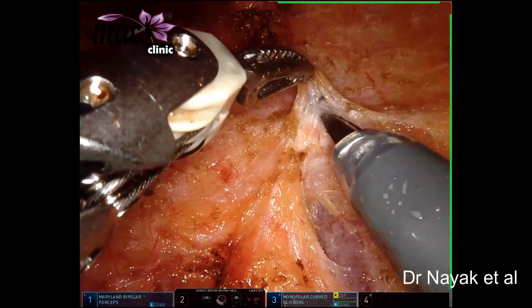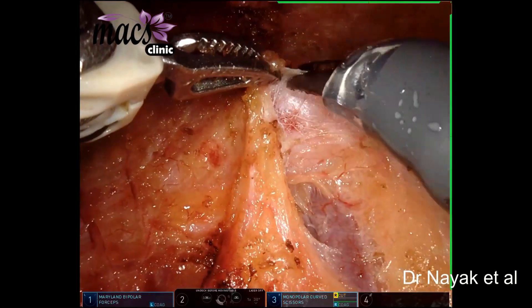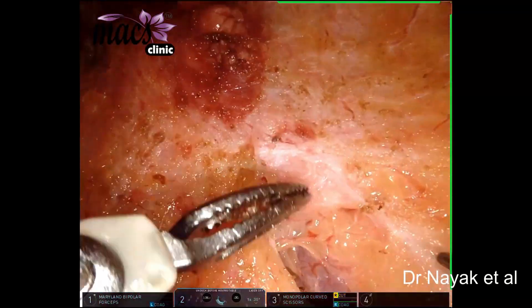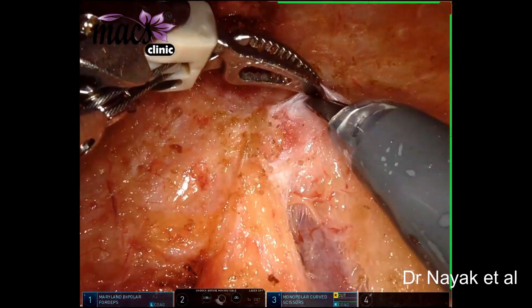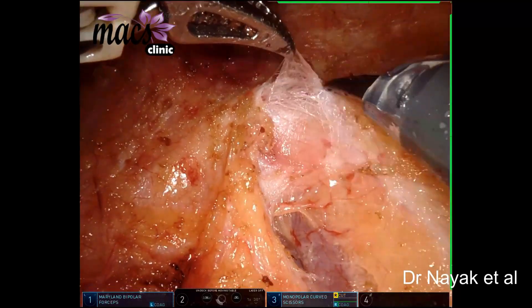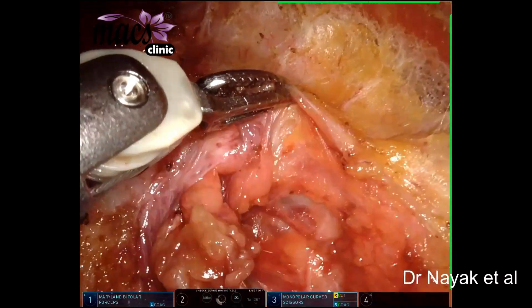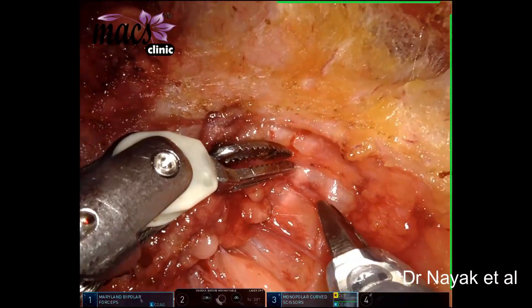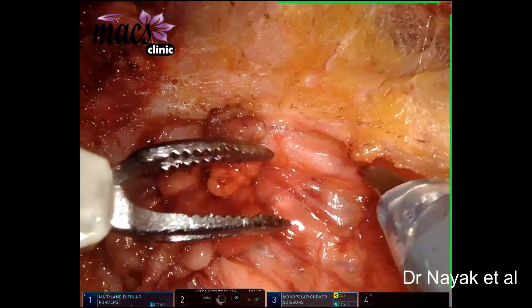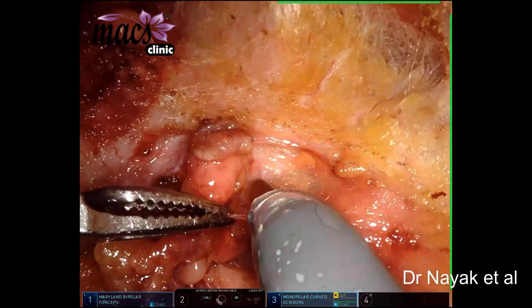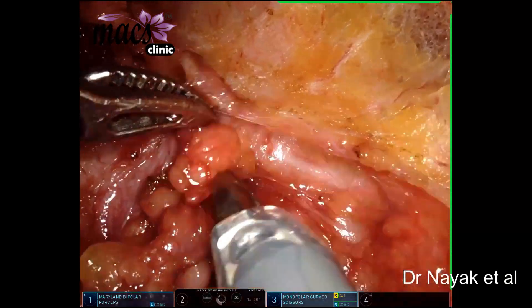The process starts by dissecting along the anterior border of the parotid gland to identify the marginal mandibular nerve. This is a retrograde technique — the PREA technique is a retrograde technique of parotidectomy. Once the marginal mandibular nerve is identified along the lower border of the mandible, we trace it posteriorly into the parotid gland.